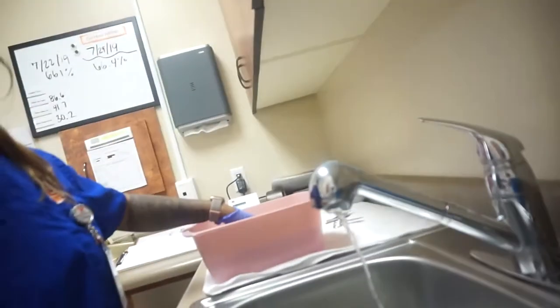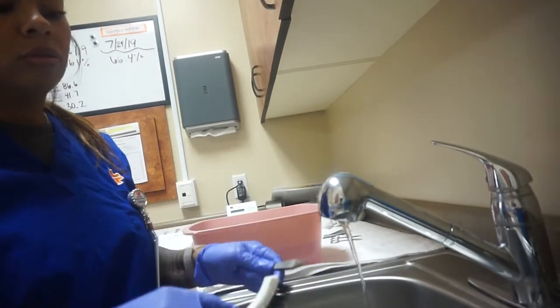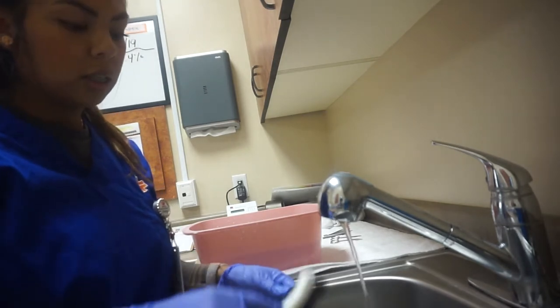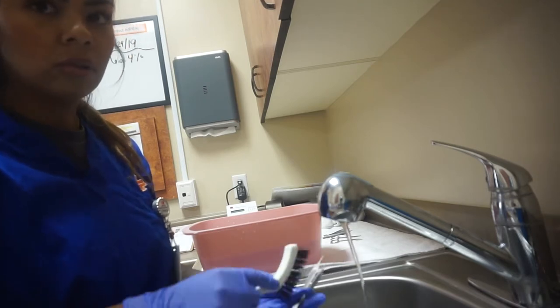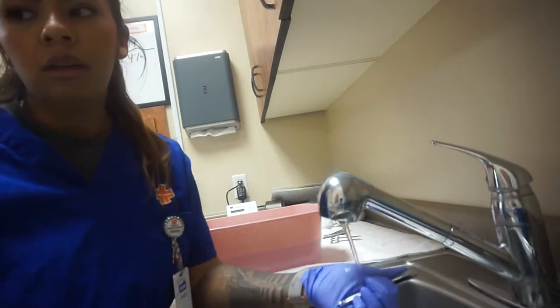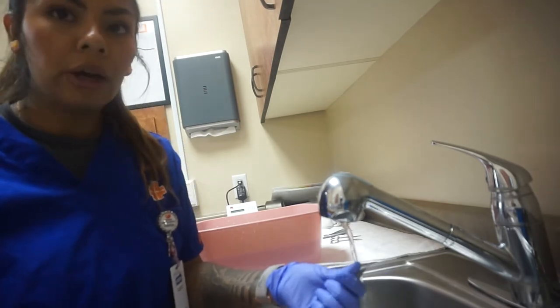So I'm going to take my tool and scrub all different sides, and scrub the ends — everything, even the handles. Just scrub until it's clean, that's all you need to know. Because we use these to remove stitches and the doctors use them to put in stitches.